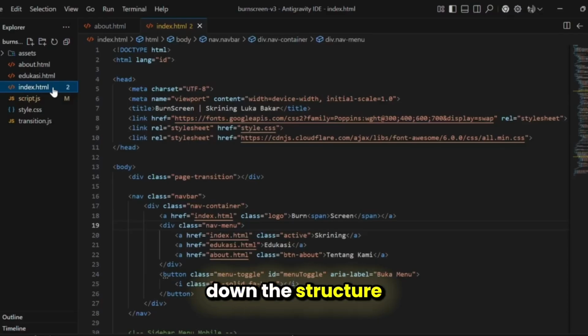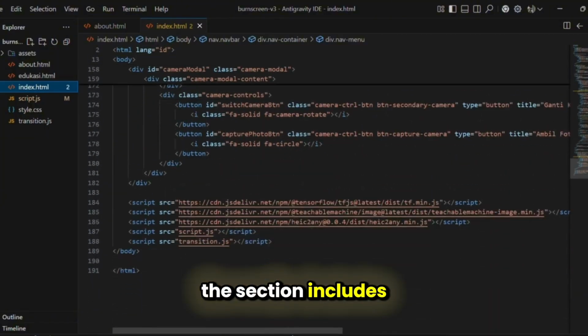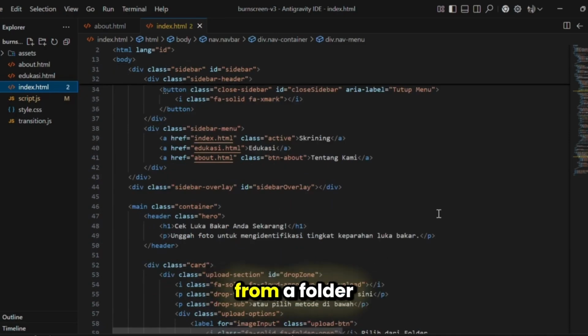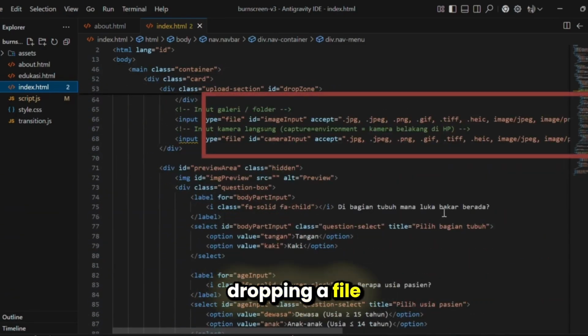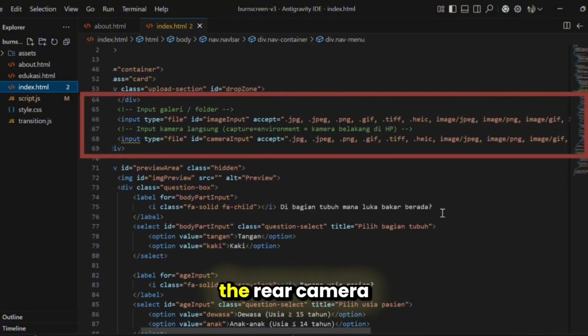Now, let's break down the structure of the program code. We will start with the index.html file, which serves as the website's main page. This section includes an image upload area that supports three input methods: selecting an image from a folder, taking a photo directly from the camera, and dragging and dropping a file into the upload area. To support use across various devices, we provide two different file input elements. The first input is used to select an image from the device's storage, while the second input is used to capture a photo, with the capture environment attribute so that the browser on the smartphone can directly open the rear camera.